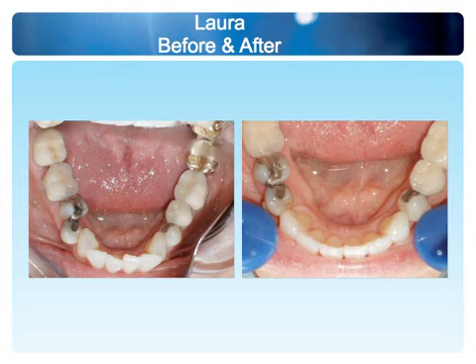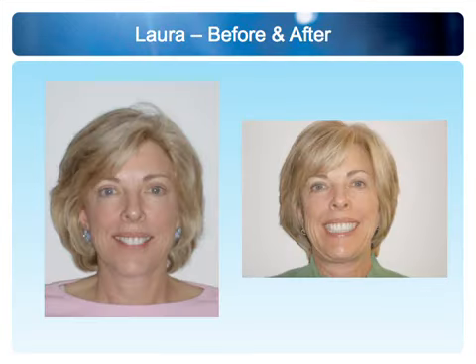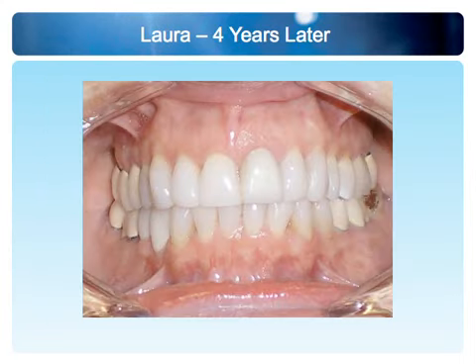teeth. And if we take a look at Laura before and after, we can see, well, that she now has a more appealing smile. She would pull those lips back and show you all those teeth because now they actually fill in her smile. And here I actually have the 4-year follow-up. So 4 years later, we have a set of photographs showing you a perfectly healthy foundation. Very nice buccolingual inclination. Those teeth are upright. So they come together with proper occlusal forces on the back teeth.